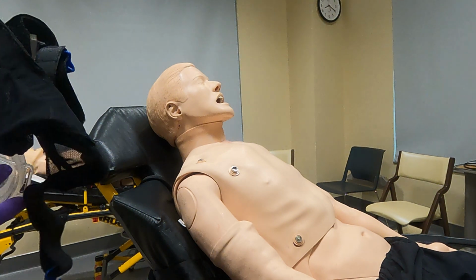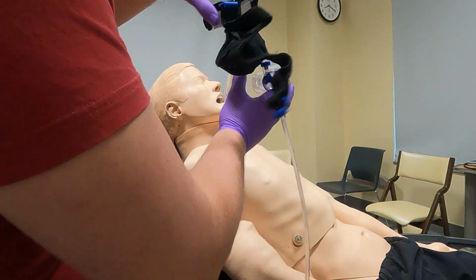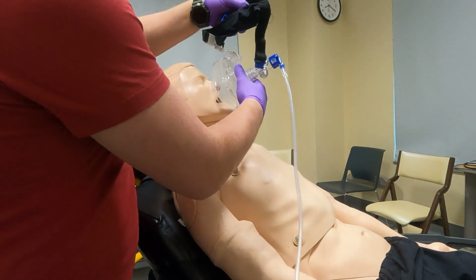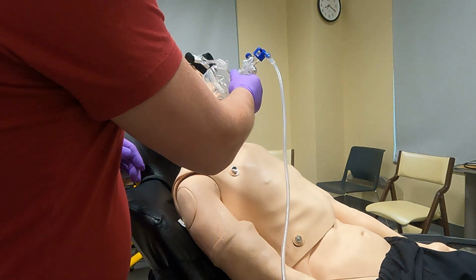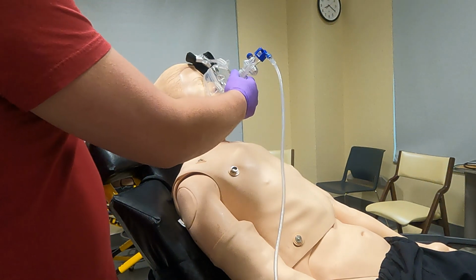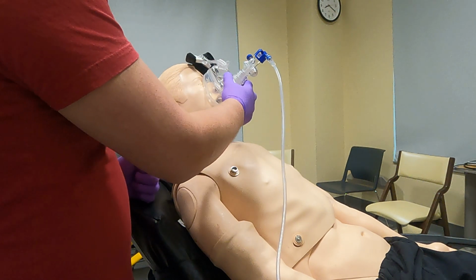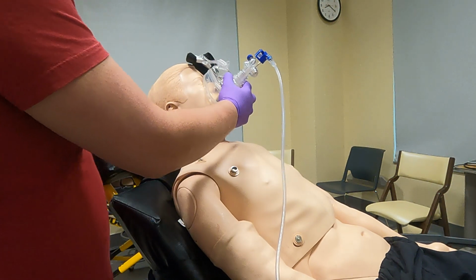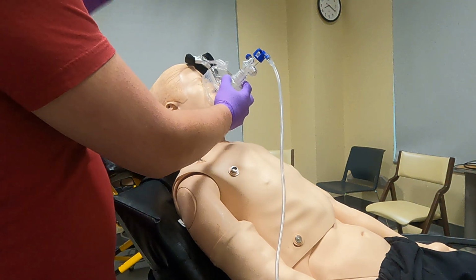I just want you to breathe as normally as possible with the device. And I'm just going to take it and put it right on their face for a minute. Not going to smush it into their face, I'm just going to hold it against there so they can get used to that pressure against them as they're breathing. Once they're used to it, give them a minute or two.